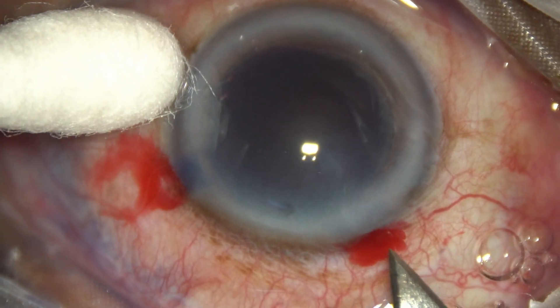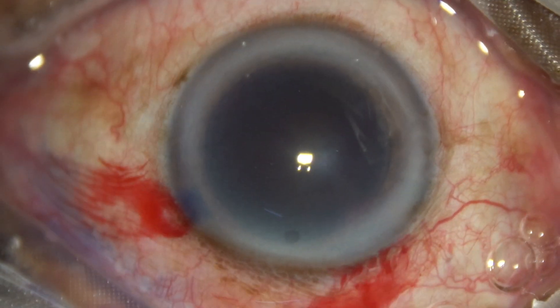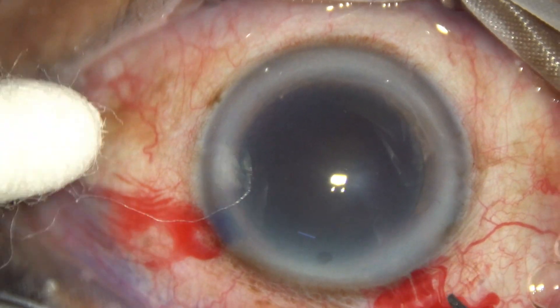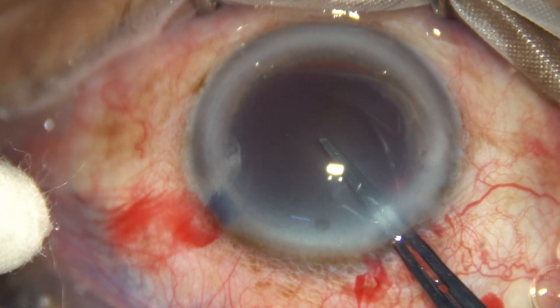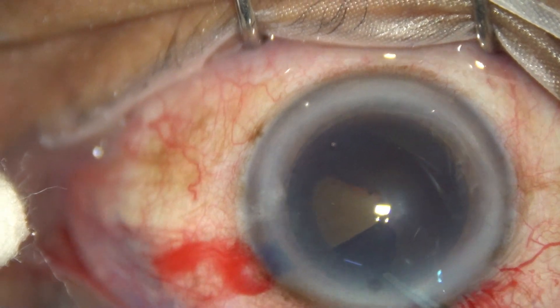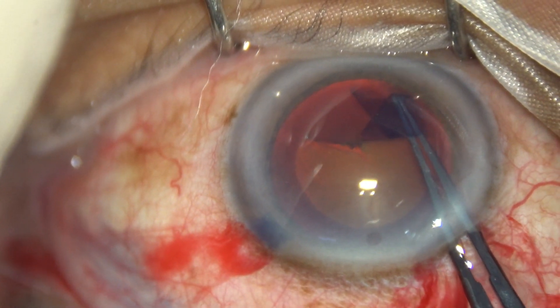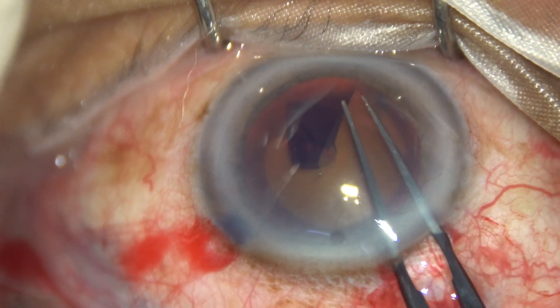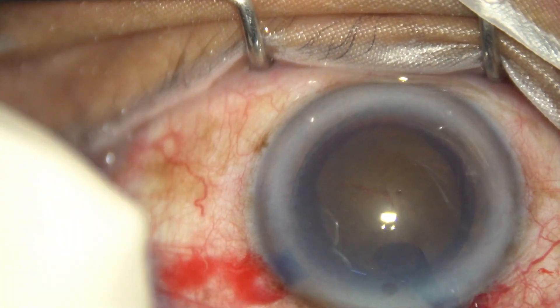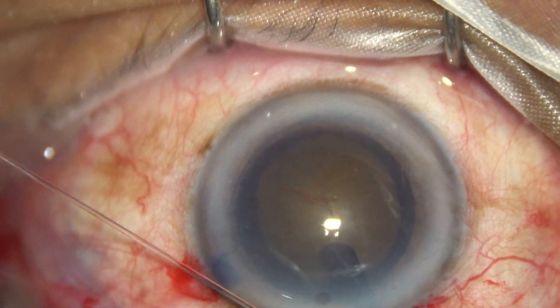The main wound is enlarged by one cut, bringing the size to about 2.9 millimeters. Now capsulorhexis is performed with the help of Utrata forceps. The size of the rhexis should be about 5.5 to 5.75 millimeters in cases of hard cataracts.